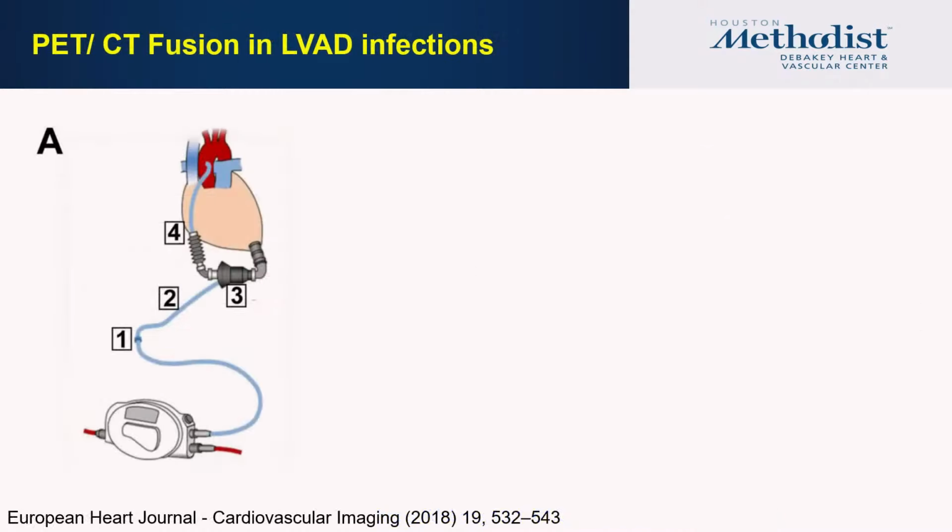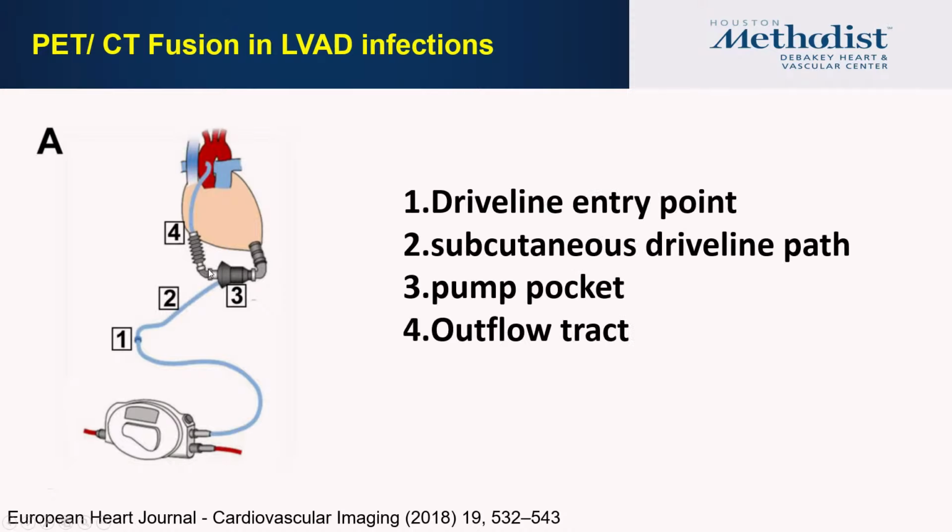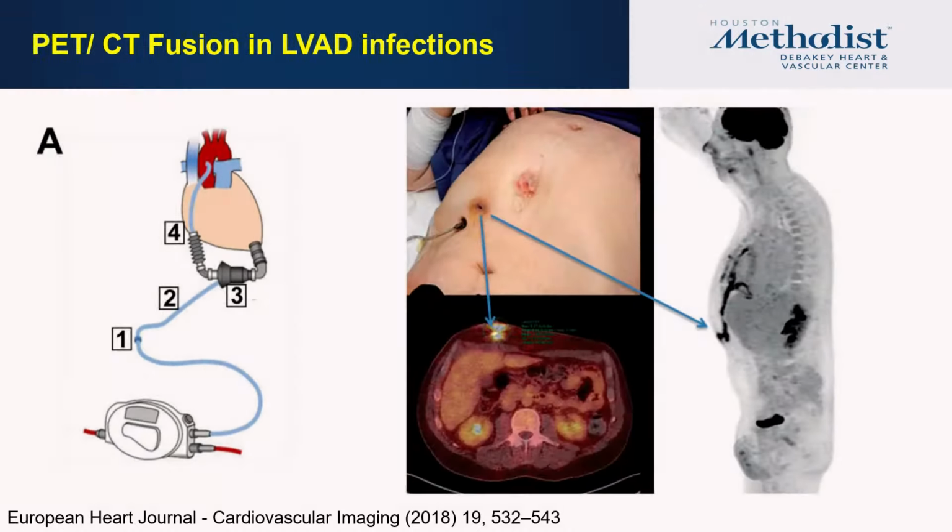And lastly, our latest frontier that we are working on is LVAD infections. As you know, these patients will have devices, and one of the common problems with these patients is that they have infections, and the infection can be at multiple sites. It can be at the drive line, at the pump, at the inflow cannula if you have a HeartMate 2, or at the outflow cannula. And all of these we can assess by FDG PET imaging.